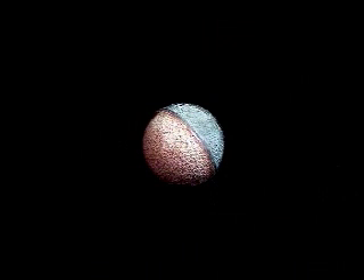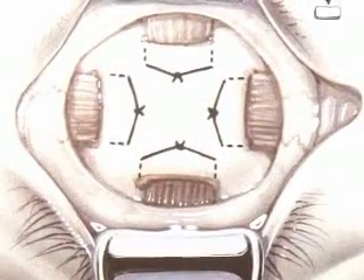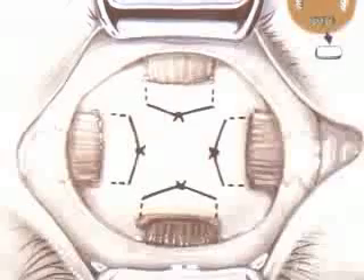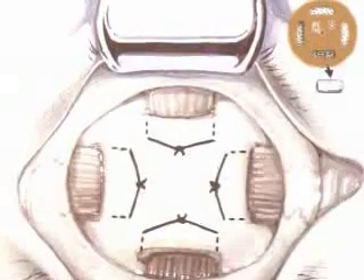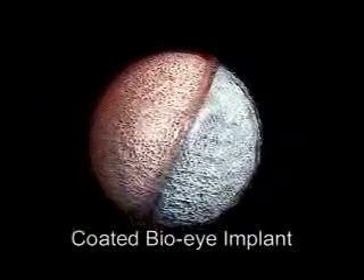Place the implant in the orbit with the proper orientation — amber anterior, purple posterior. Because the surface is smooth, the coated implant will slide into the orbit easily. Attach the rectus muscles to the respective windows. Close Tenon's capsule carefully with interrupted 5-0 Vicryl suture, and then close the conjunctiva in a separate layer using the same suture material.